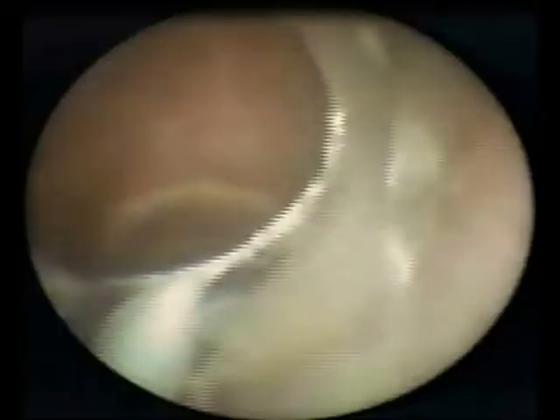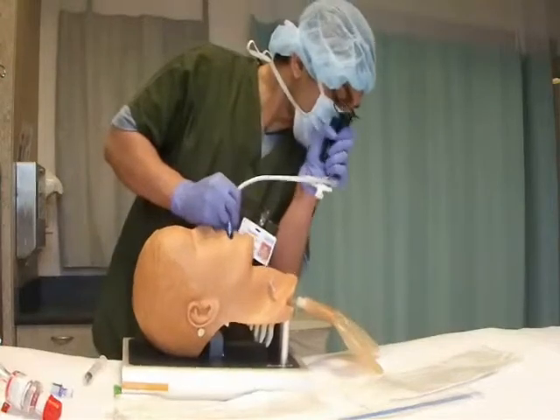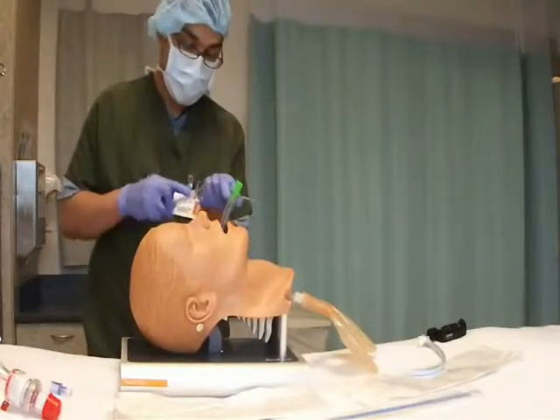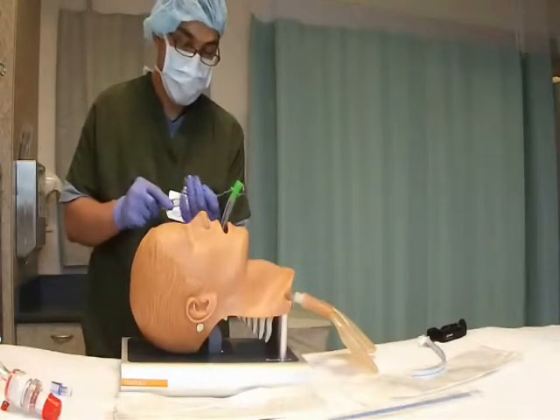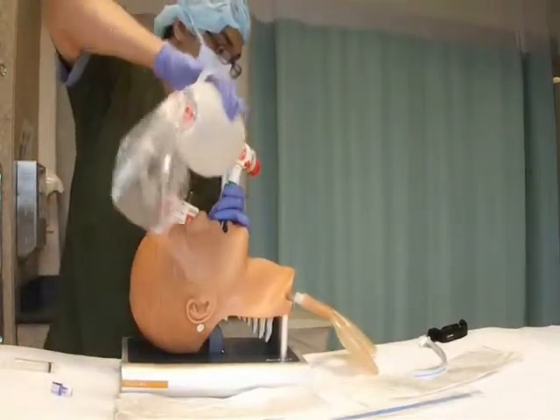To revise: follow the base of the tongue, visualize the epiglottis, go below the epiglottis, visualize the vocal cords, get near the vocal cords and go through them into the trachea, then push the ET tube into the trachea while withdrawing under direct visualization. After removing the stylet from the endotracheal tube, the adapter is placed back in and the balloon is inflated. Confirmation of correct ET tube placement is done by capnography, seeing chest movement, and auscultation with ventilation.